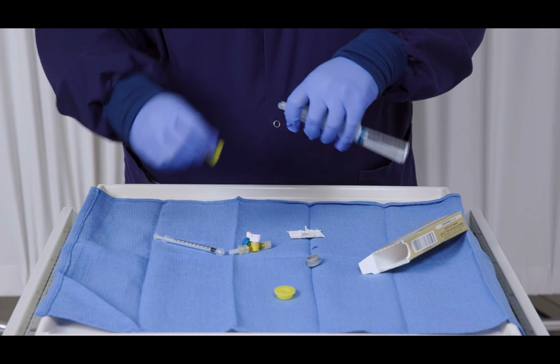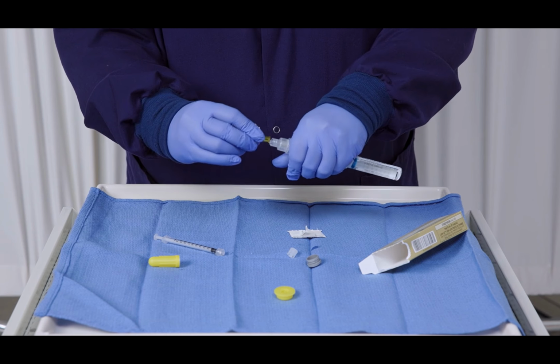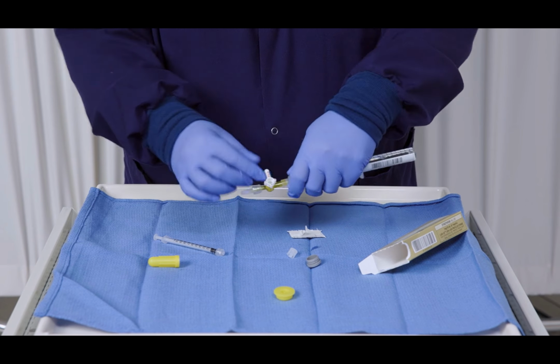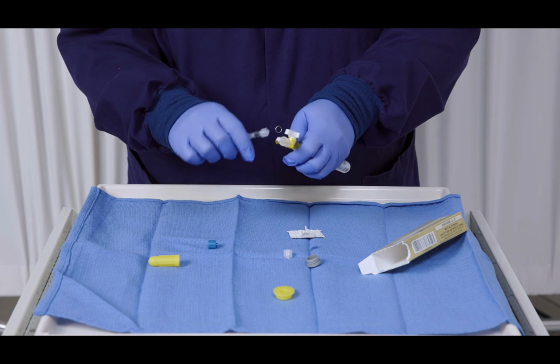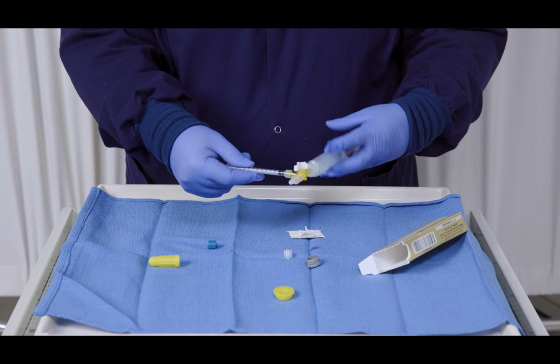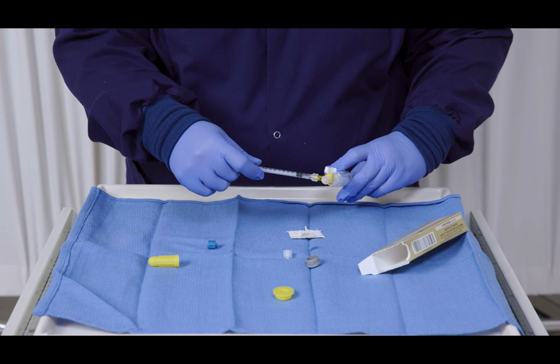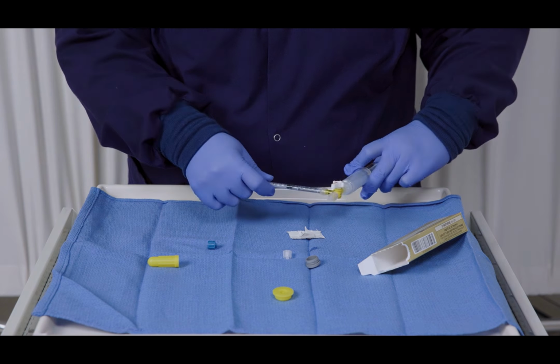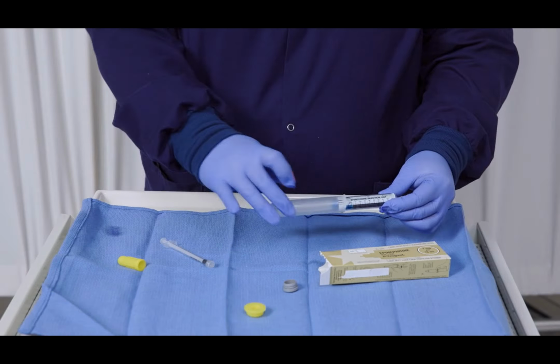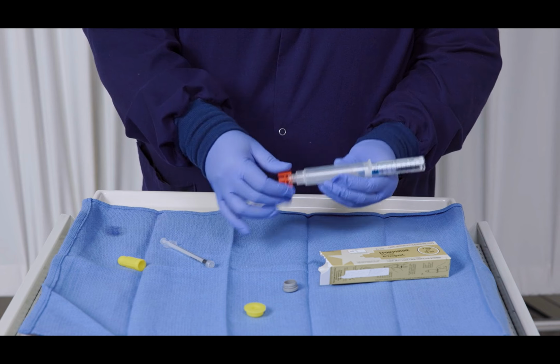Attach the 3-way stopcock and attach the 1 ml syringe. Turn the stopcock off to the unused end, opening the stopcock between the syringe and the epinephrine vial. Give the epinephrine vial a push and fill the syringe. In place of a 3-way stopcock, you can also use a medication dispensing connector.